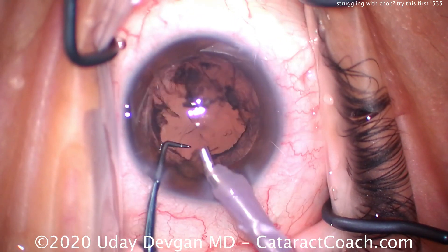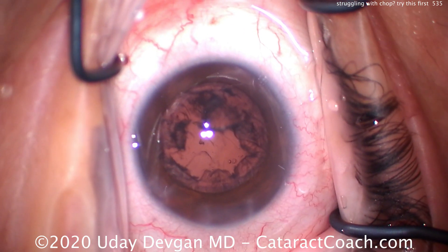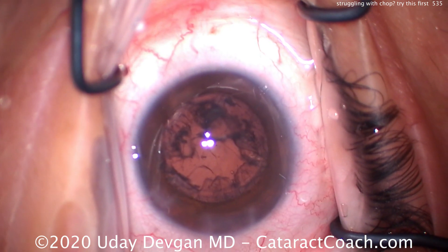The entire nucleus is removed in this case in just about two minutes from the start. That's very efficient. Of course, it's not about speed — it's about efficiency. Here comes the IA probe to clean up.